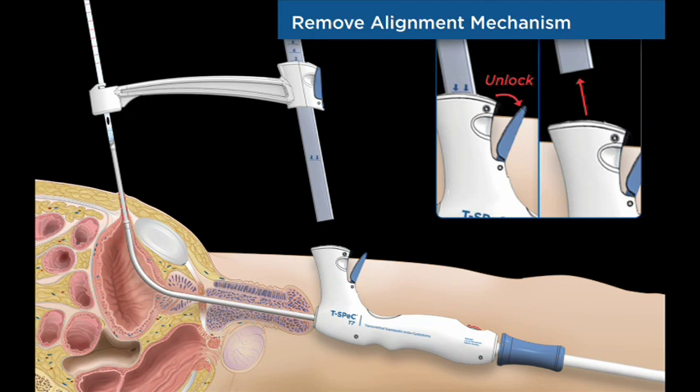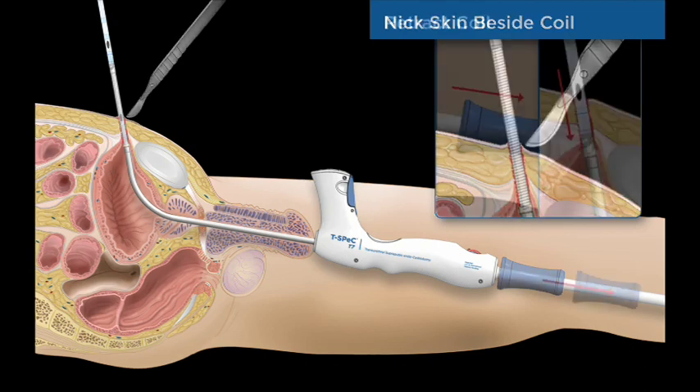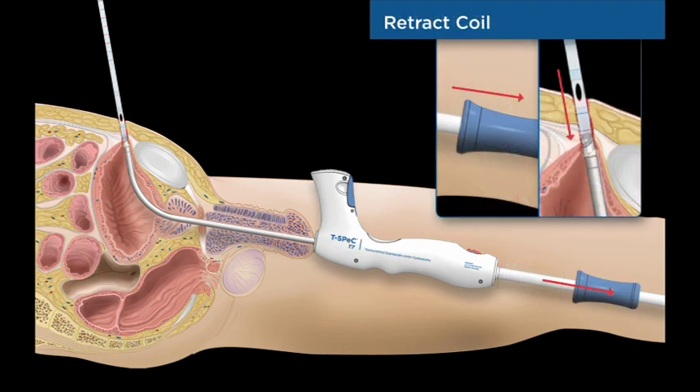The alignment mechanism is removed by opening the mast latch and lifting the assembly from the handle. A scalpel is used to make a small skin incision directly adjacent to the coil to widen the surgical track for the catheter. The handle lock is released and the coil is retracted into the sound, then the handle lock is re-engaged.